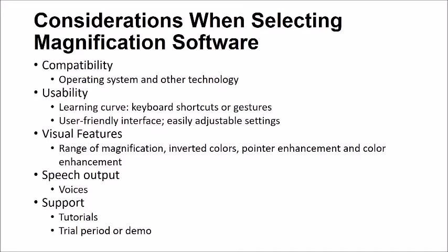So if a magnification software is something that you would consider, some of the things that you might want to think about is the compatibility of that software with the operating system that you use and any other technology that you have hooked into your computer. You also want to think about its usability.